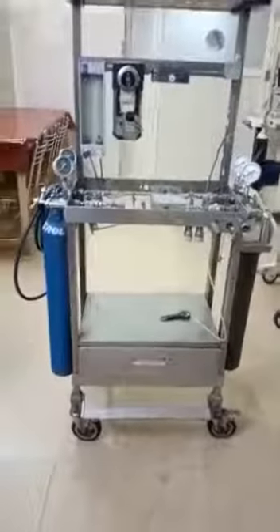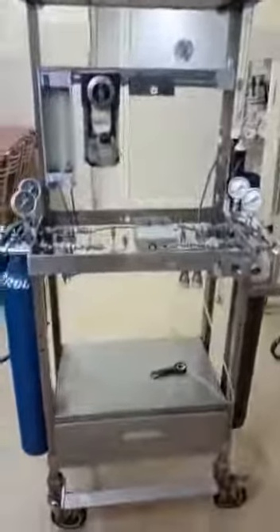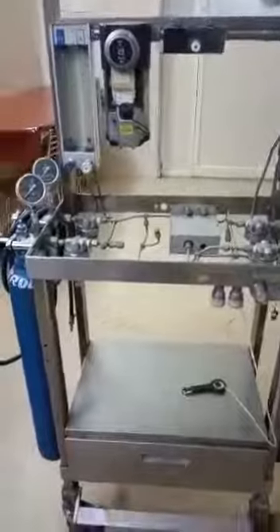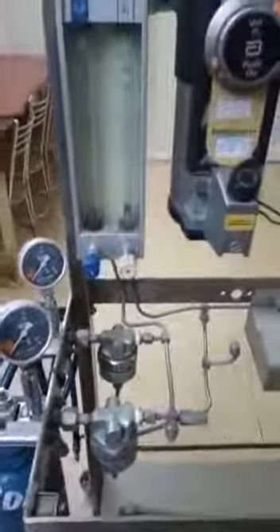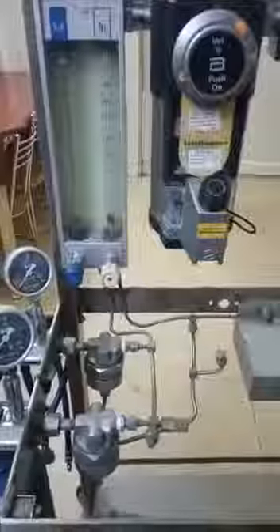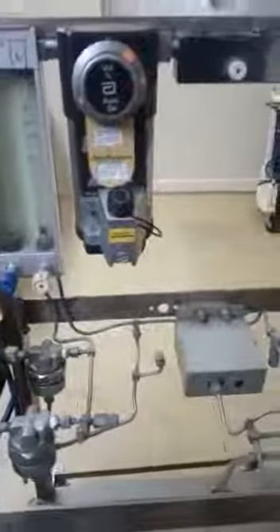Today I am explaining a historical landmark in anesthesia history. It is the continuous flow anesthetic machine, or Boyle's machine, which is designed to provide an accurate supply of medical gases mixed with an accurate concentration of anesthetic vapor, and to deliver this continuously to the patient at a safe pressure and flow.